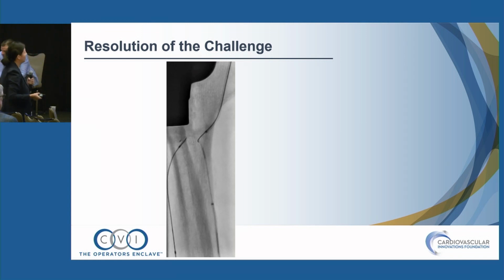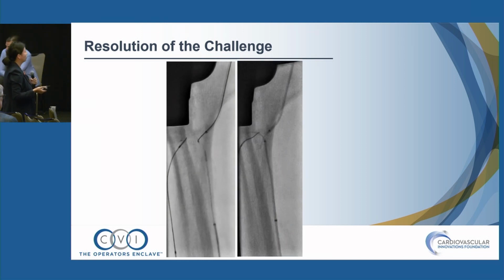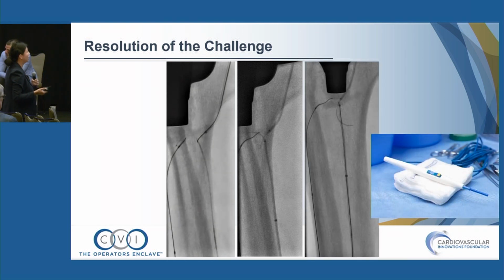This is a technique where I mother-daughter a 018 microcatheter inside of a 035 microcatheter. There's a 035 Navi that's about 65 or 90 centimeters with a CXI mother-daughtered inside it, and that way I can wire escalate into a 035 if needed. So I brought a nuclear weapon, a 035 stiff Glidewire, from the top and from the bottom, still not able to connect into the P3 segment.